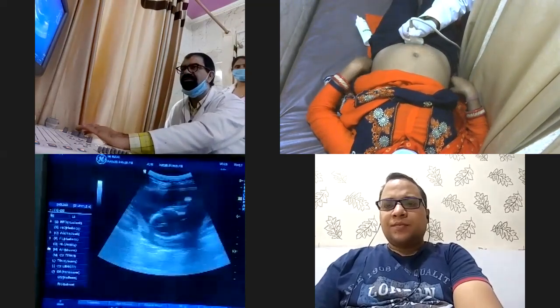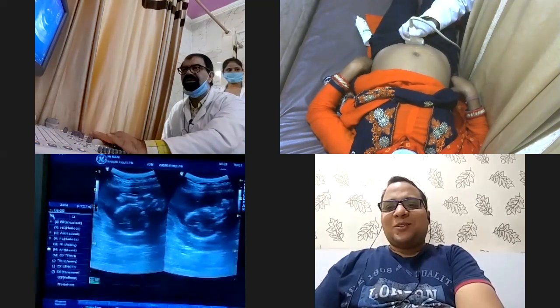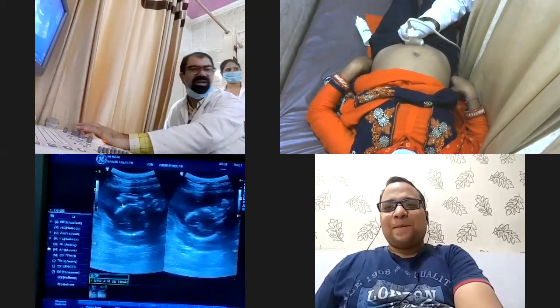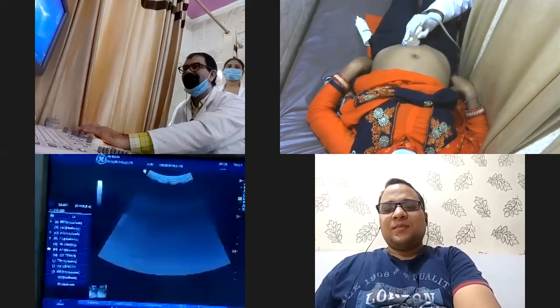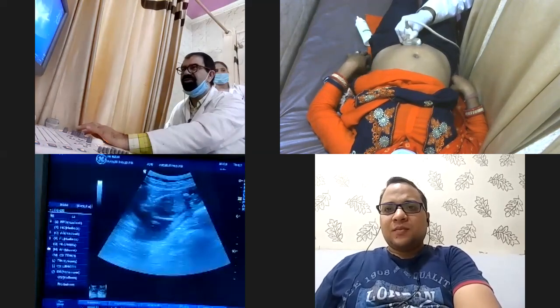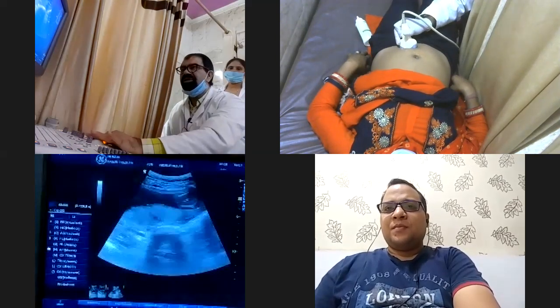Of course this is a fetal ultrasound. So are you doing fetal ultrasound also? No, sir. I'm very new to ultrasound. I'm just starting ultrasound after this course. Okay. So those who are already doing the ultrasound, they can see that there is a fetal head over there. We are not discussing the fetal ultrasound over here. But my point for now is to make you understand the longitudinal and the transverse section and the rotation of the probe. Okay. Now I am seeing a placenta over here.